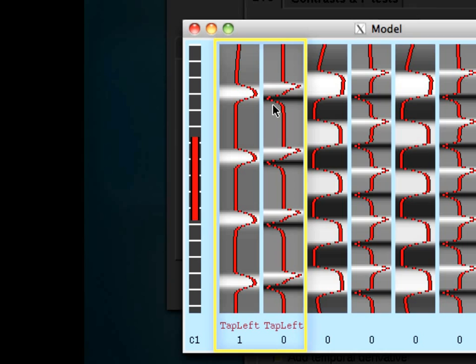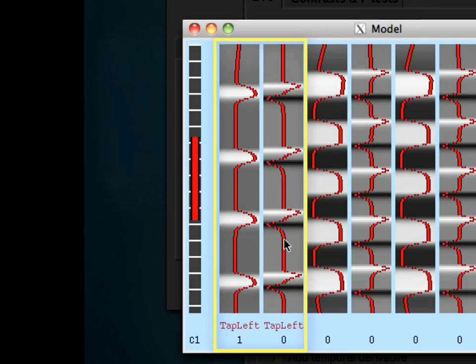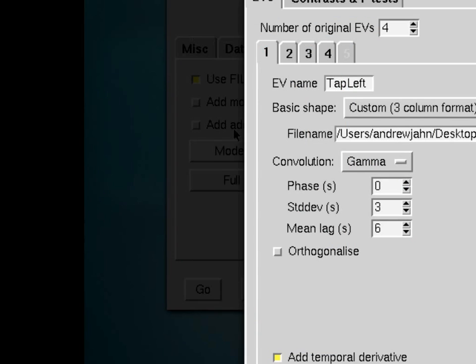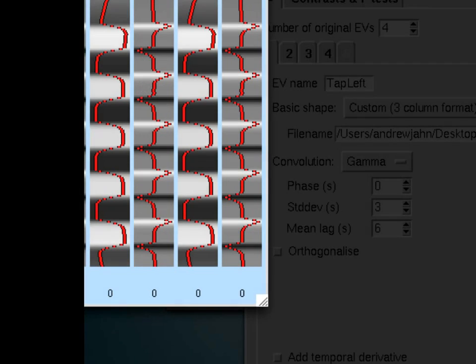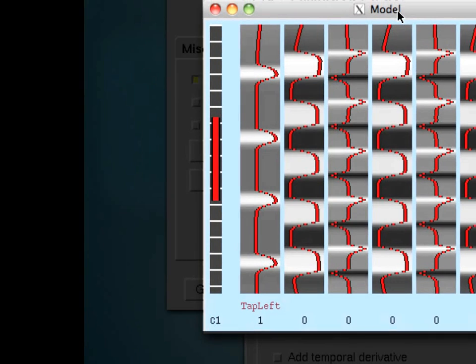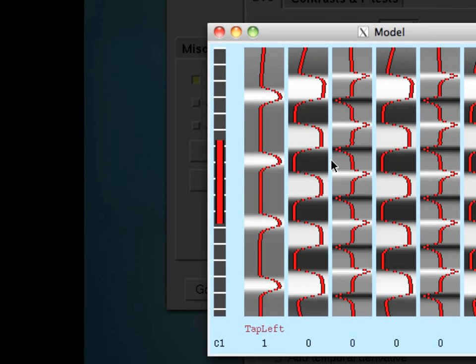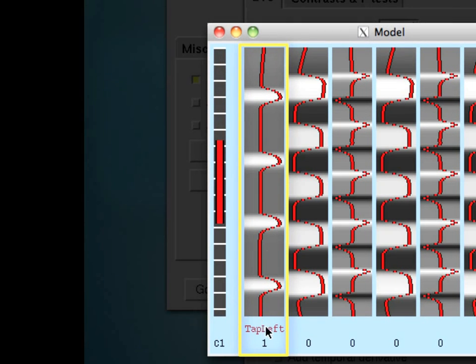Now this second column here, you might notice that down here it says tap left underneath both of these columns. The second column will attempt to account for any sort of temporal derivative. So in other words, if I go back and I don't apply a temporal derivative, I will essentially only have one column for the tap left condition.